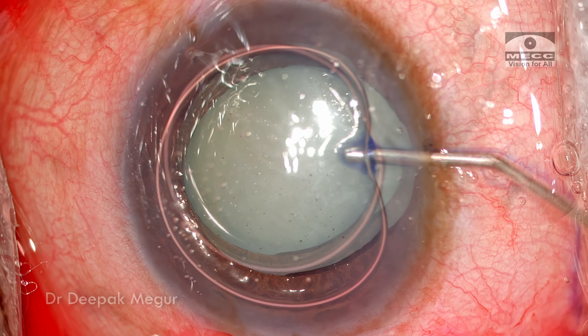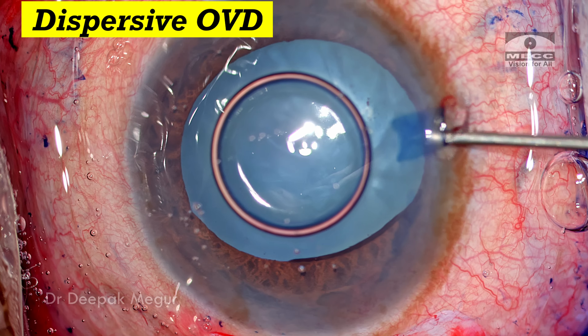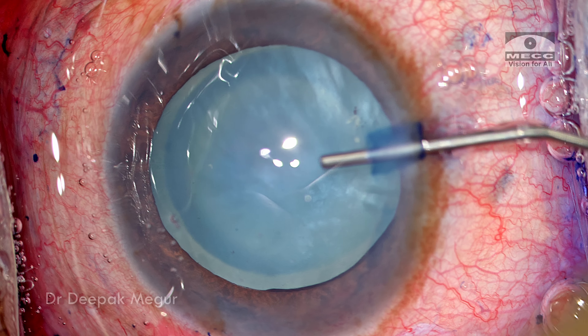The anterior capsule is stained and the anterior chamber is being filled with dispersive OVD to maintain a deep anterior chamber and also to protect the corneal endothelium.